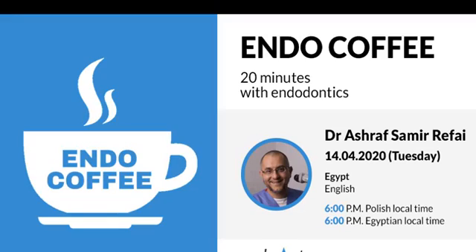The dynamic of movement, I am using the rotation. I don't know if this is the question. I am using the rotation. I'm doing a push-pull, in and out action with brushing. This is the way I work with it. You cannot not do the brushing, because if you don't, sometimes you will have very thin canals. The brushing is done, of course, only in the coronal part.